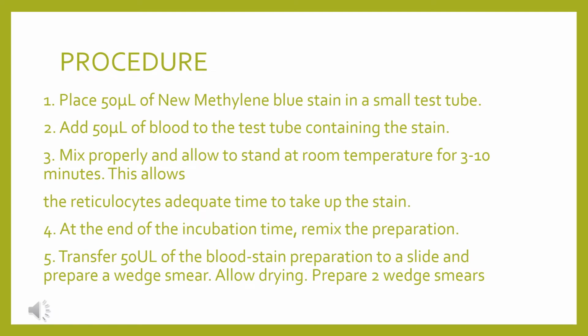For your procedure, just like what we said in our lecture, you have to place equal amounts of your blood sample and your stain. So you place 50 microliters of your new methylene blue and then 50 microliters of your blood in the test tube. You mix properly and allow to stand at room temperature for 3 to 10 minutes. So this allows the reticulocytes adequate time to take up the stain.